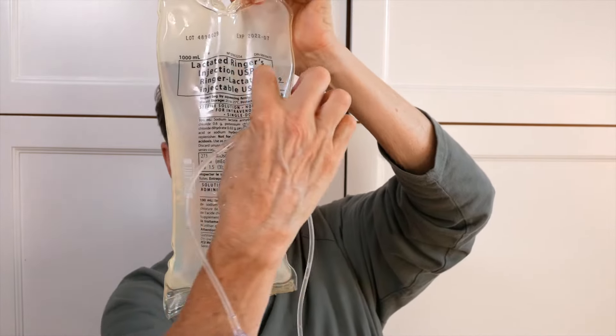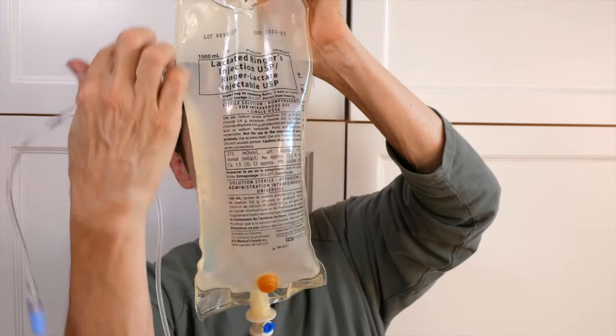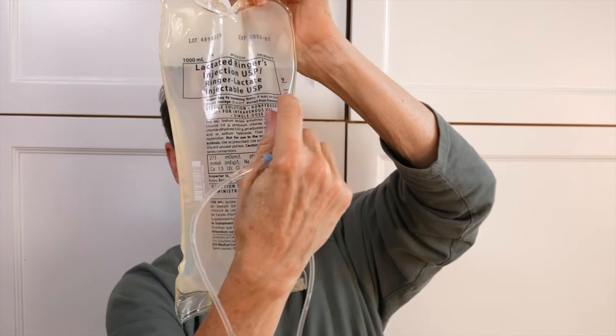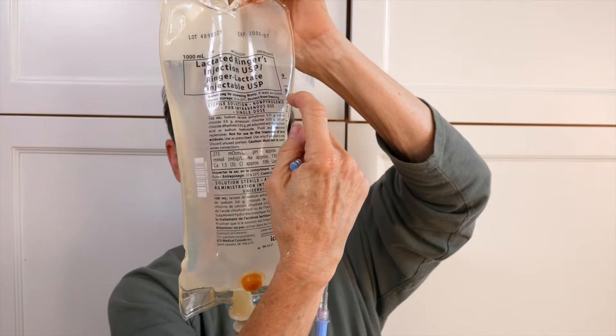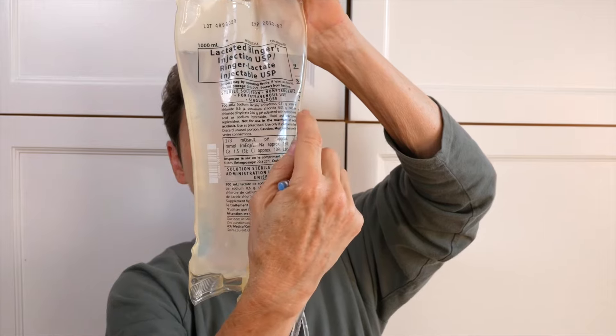You can see that the fluid line starts above the nine. And that is actually, regardless of what it looks like on the bag, this is the one liter. When I go to give Nimitz fluids, I'm going to take it down to eight and a half because he gets 150 mils a day.